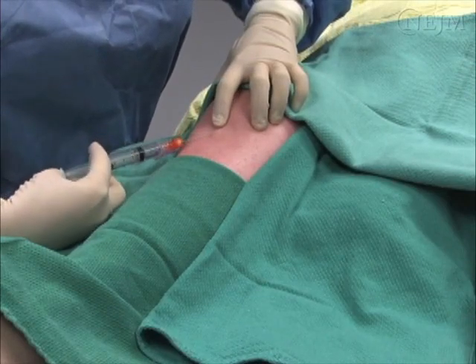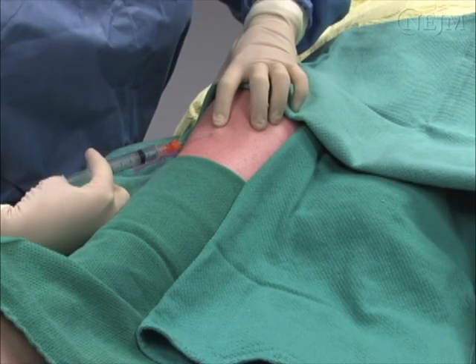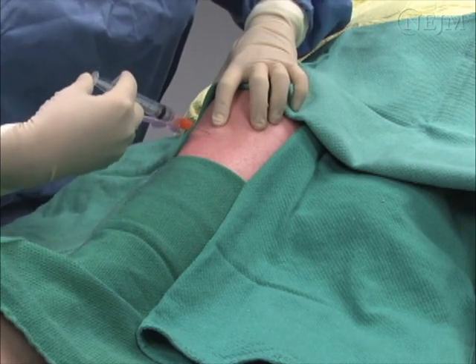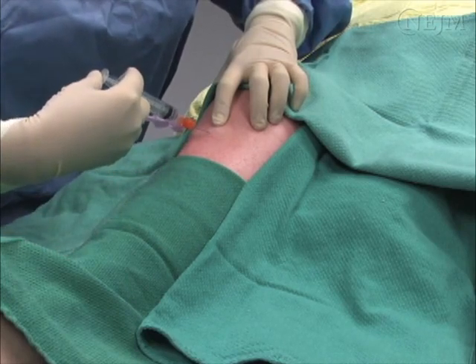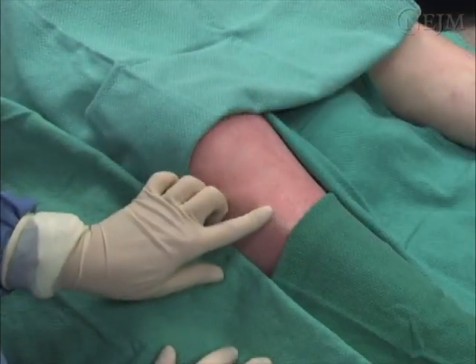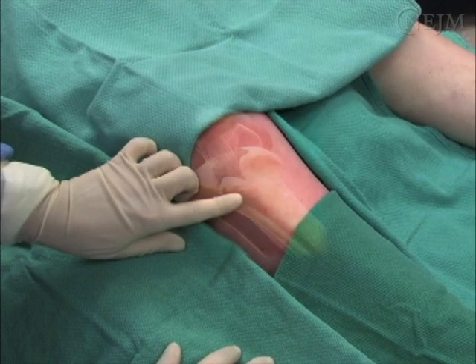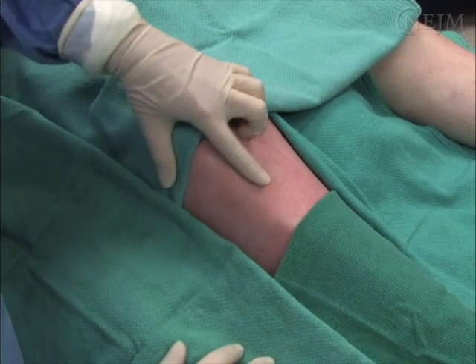If the patient is conscious, infiltrate the skin and subcutaneous tissues and the periosteum with 20 to 30 milligrams of 1% lidocaine. Identify the tibial tuberosity. The desired insertion site is the flat medial surface of the tibia medially 1 finger's width away from the tibial tuberosity.